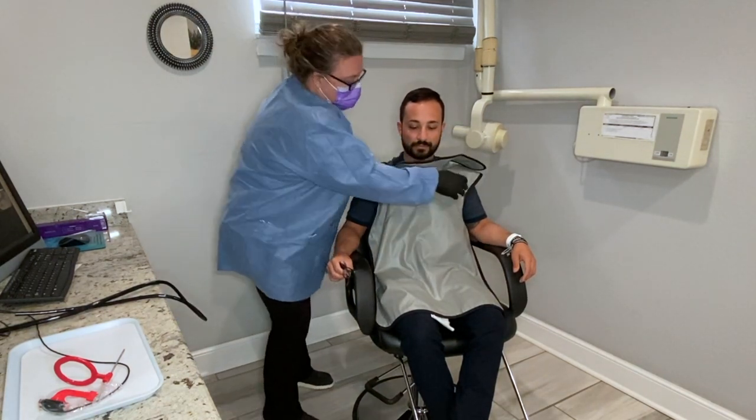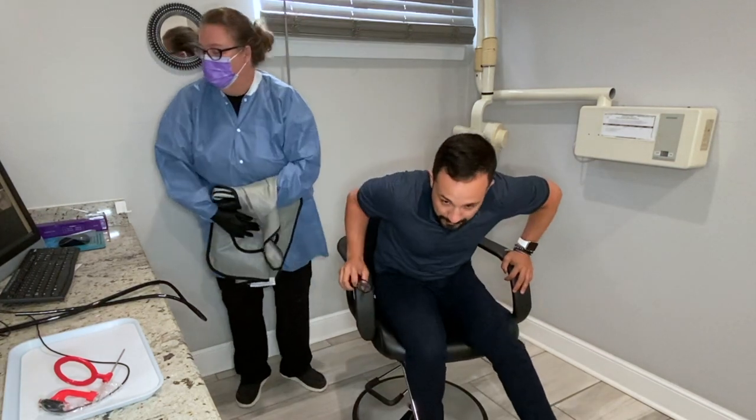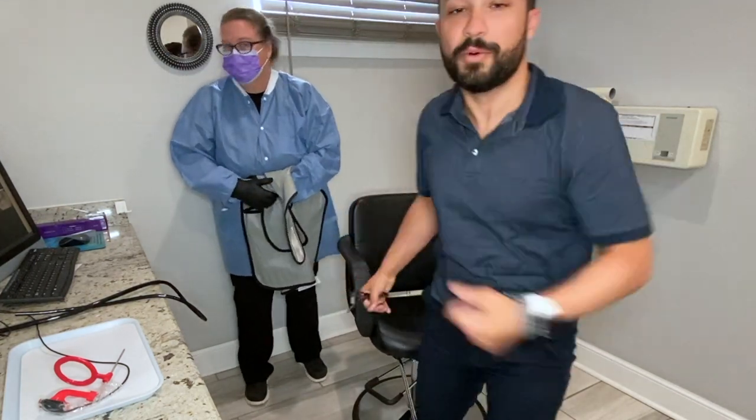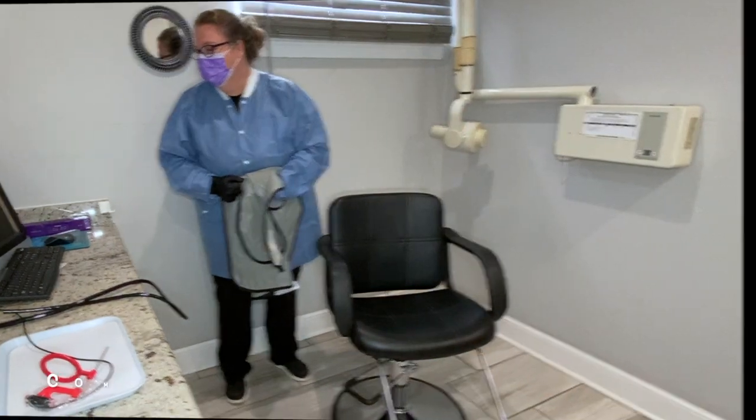Take this off and check out our x-rays. Thank you so much — I'm so excited to do our next x-rays.